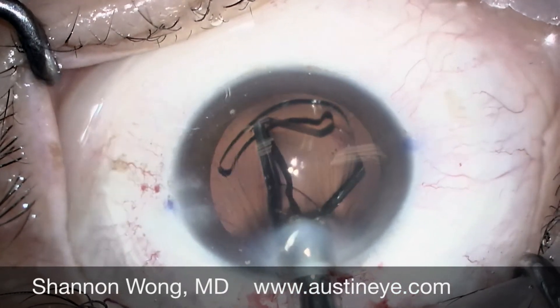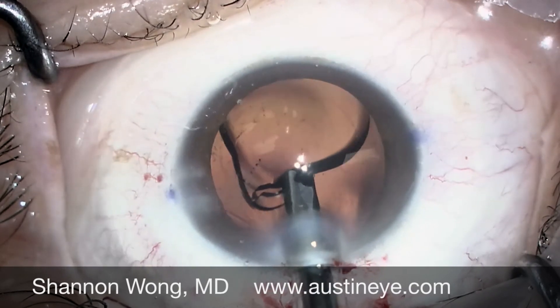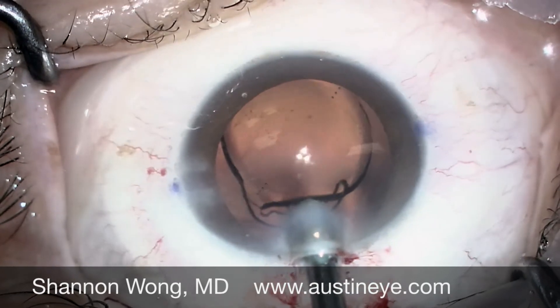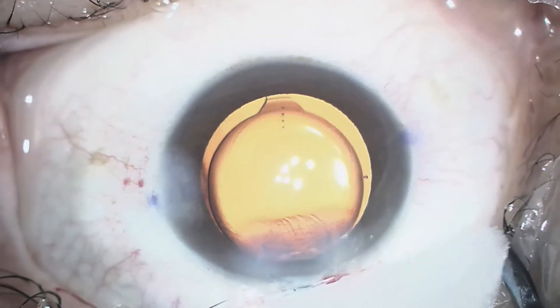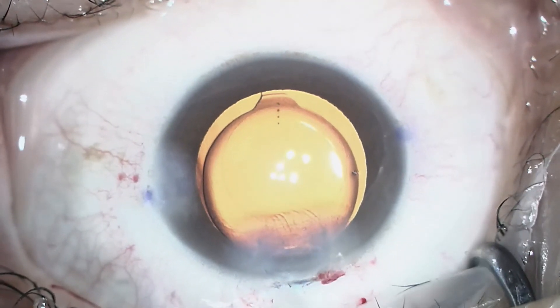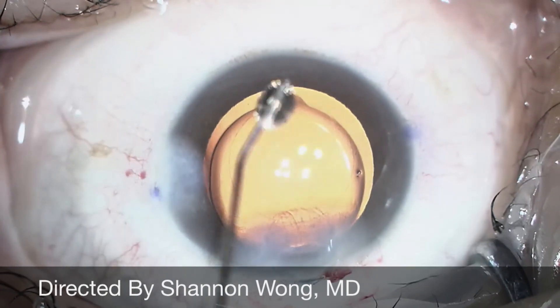And it's delivered safely as shown here. The haptic is in the tip of that metal piece that is used to push the implant into the eye. We then rotate the lens into proper alignment and remove all the viscoelastic. And this patient did quite well. This demonstrates proper insertion of an acrylic lens implant using the AMO platinum inserter. Thank you for your time and attention.